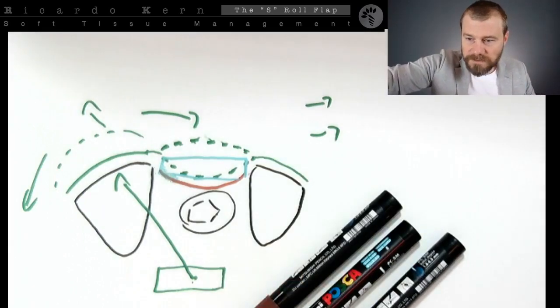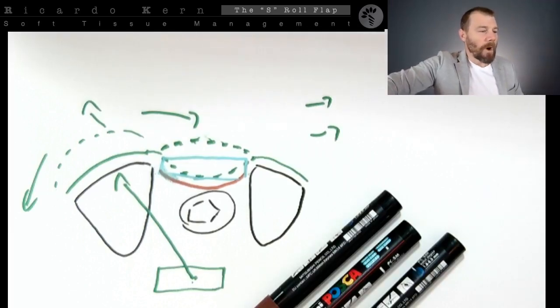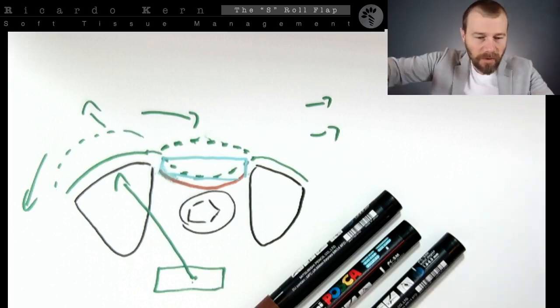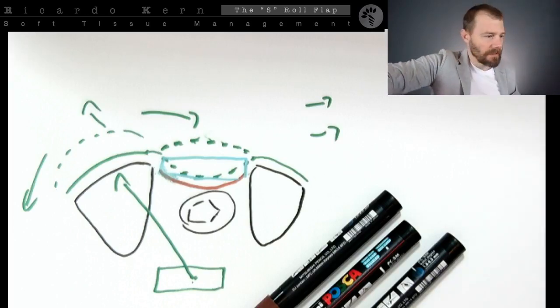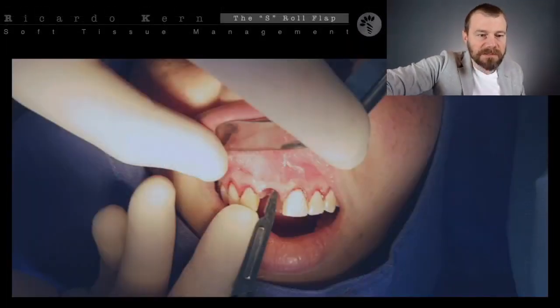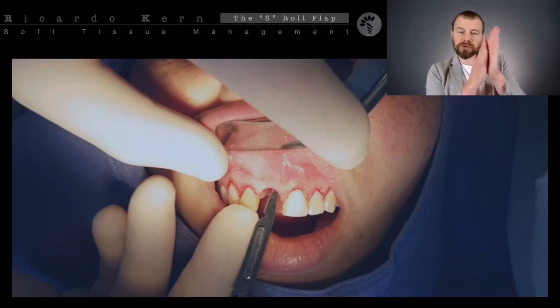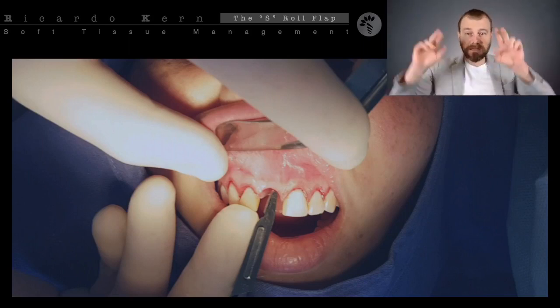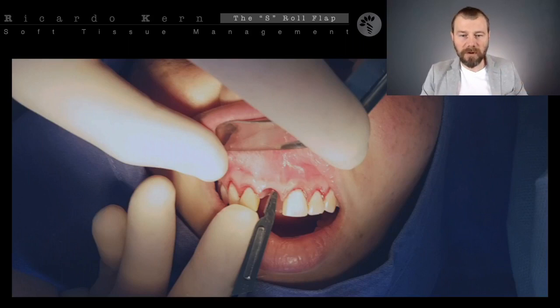So let's move once more. And so here is how I can treat and prepare this area, really doing an incision close to the bone surface, close to the threads, scraping the blade on this surface, and when it's possible, you're going to remove this crown from the place to have free access to the intrasulcular area of the old crown, okay?